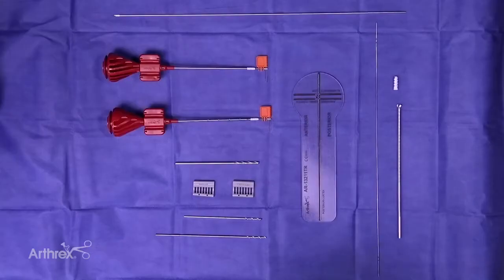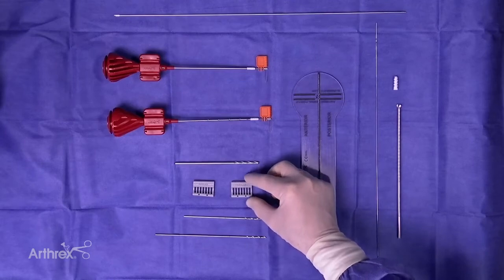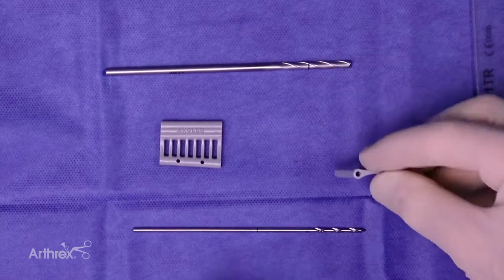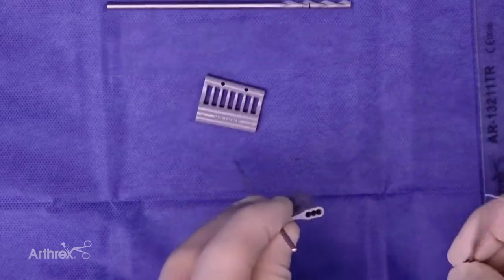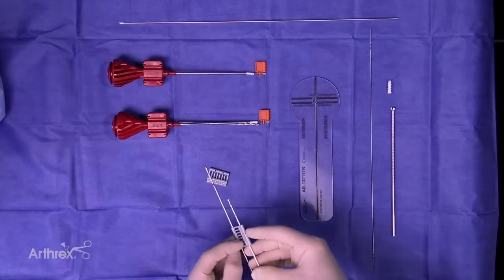Another nice feature is a new parallel and also a divergent guide sleeve for drilling your pins. The parallel one lets you drop your pins in perfectly parallel after you put your shorter pin in, and you can go from 15, 17.5, to 20 millimeters in terms of your distance between your anchors.